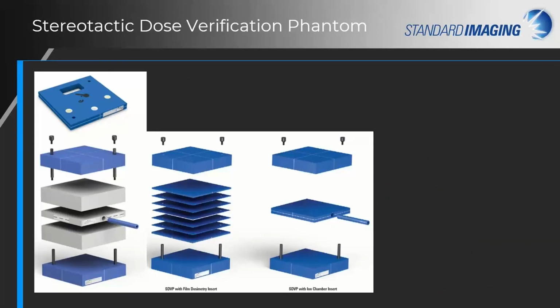No presentation about CyberKnife QA is complete without talking about our full package solution. That package includes our Stereotactic dose verification Phantom, SDVP for short. This compact Phantom is versatile and easy to use for QA commonly done with detectors and film.